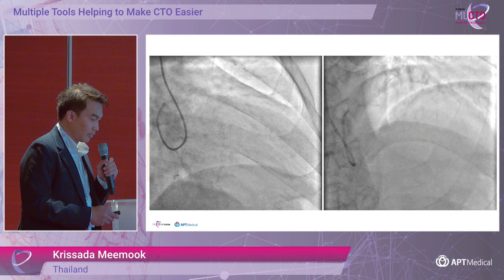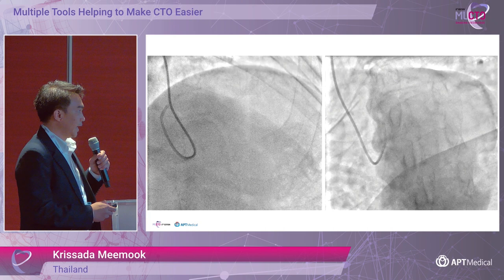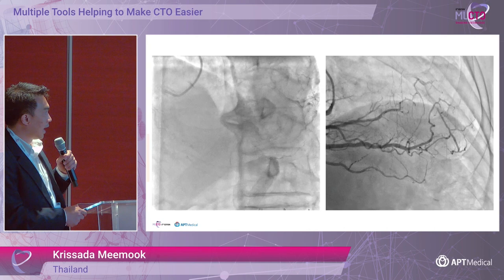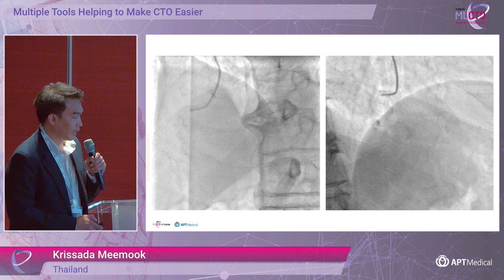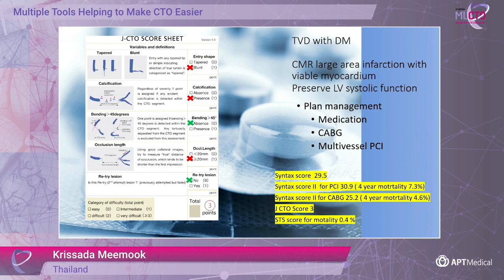You can see the total occlusion of the proximal to very ostial LAD. You cannot see the stump at the very ostium — the occluded segment is about 2 cm. On the right, you can see severe stenosis on the distal RCA, and the RCA provides collateral to the mid-to-distal LAD. There is very good collateral from the septum and also the PDA. The J-CTO score in this case was three.